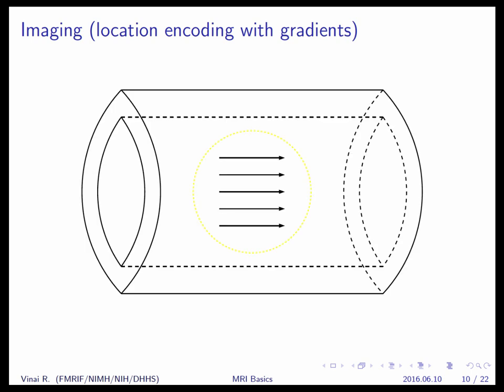Okay. So most of our magnets, schematically, it's a good-sized cylinder, but it's only at its rated field, i.e. 3 Tesla, 7 Tesla, 9.4 Tesla, in a fairly well-defined ball around the center of the magnet. Out here, the field kind of falls away pretty rapidly. But in this ball around the center, which is about 50 to 60 centimeters in our clinical systems, it's either 3T or 7T to a fairly well-given spec, like parts per million. And this is one thing that we essentially push the vendors for when they're delivering a system to us, that we have as nice a uniform field as possible in this middle region.